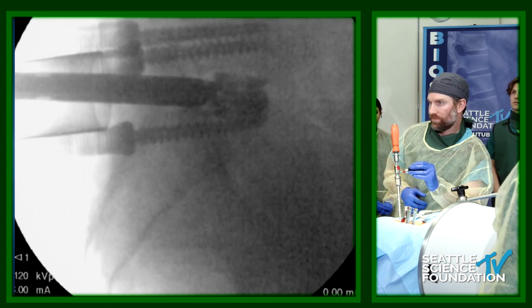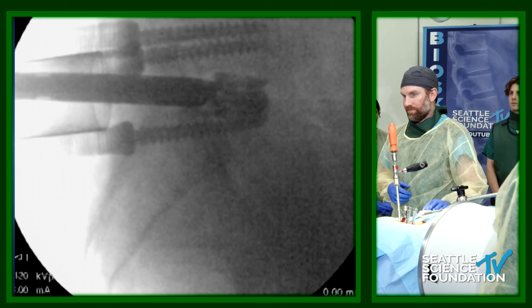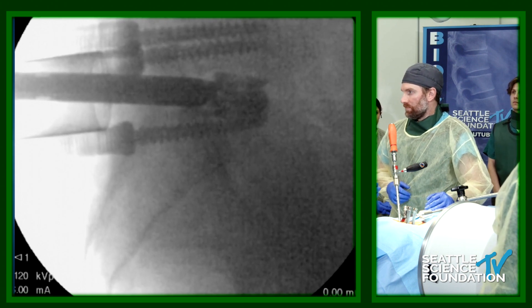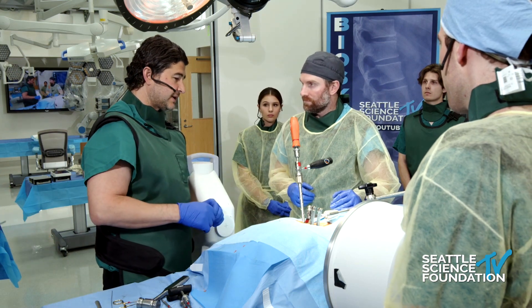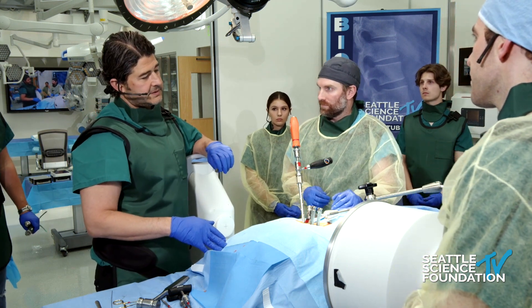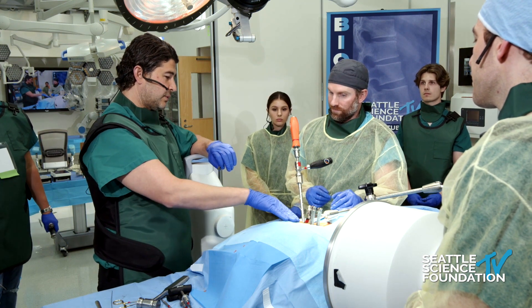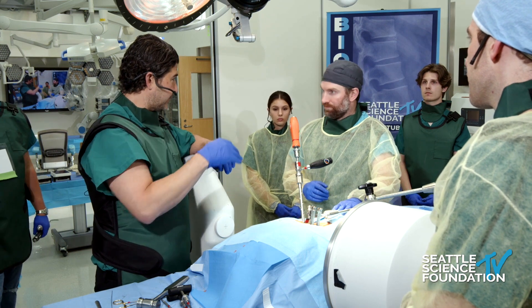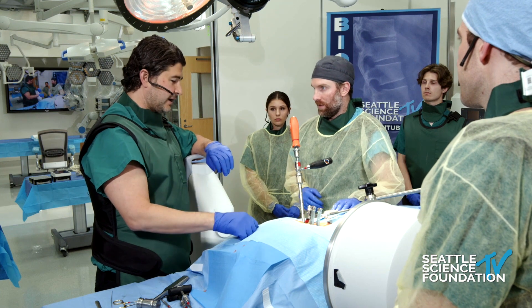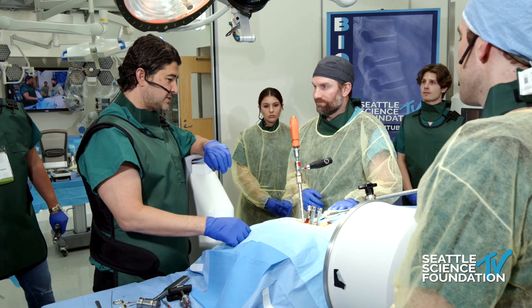So that's kind of a five-minute demonstration of what we did there. One thing that is difficult to do minimally invasively is to get the contralateral decompression. Usually in these cases patients will have some element of stenosis, whether that's foraminal or central. Sometimes what we'll do is angle our tube and try to go all the way across to the other side. But if you look at the post-op x-ray, you'll still see that lateral recess. So that's one of the challenging parts.